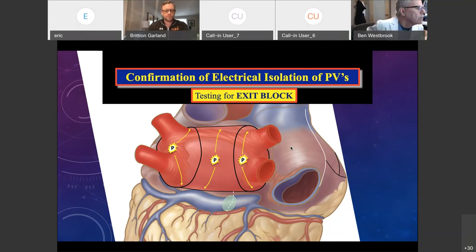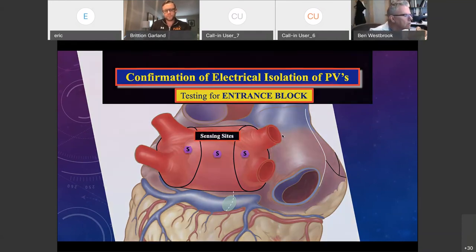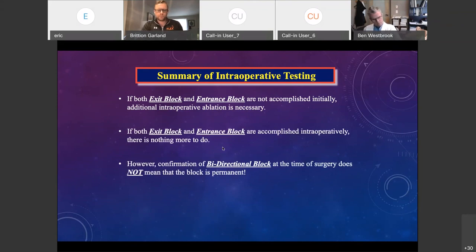If you don't get block, there's not much else you can do besides document it and ensure that if that patient has recurrence, they're sent back for catheter ablation down the road — usually three to four months later. These are the pacing sites for testing entrance block — sensing in these areas. In general, if you get entrance and exit block initially, you don't have to do anything else. If you don't get it, you need to do additional ablation using the floor line technique. If you get exit block and entrance block intraoperatively, there's nothing else to do.